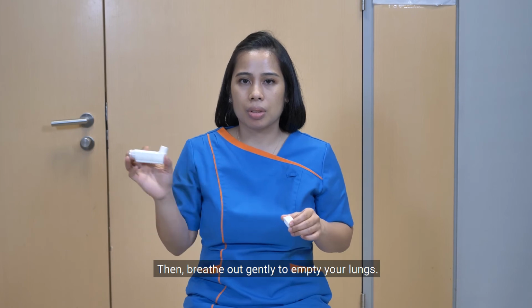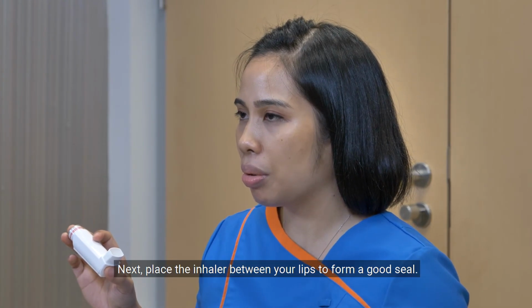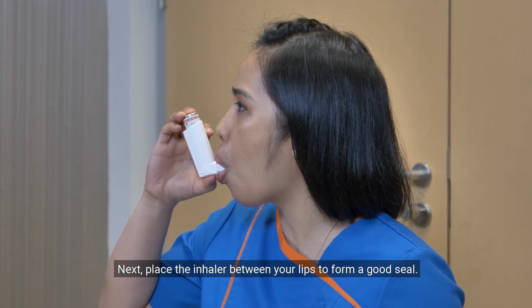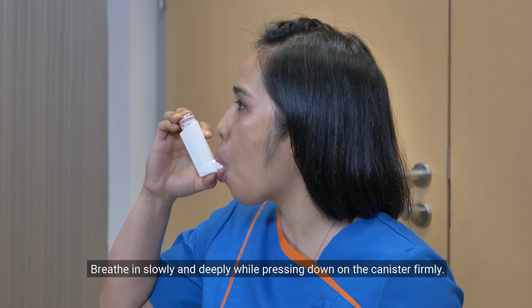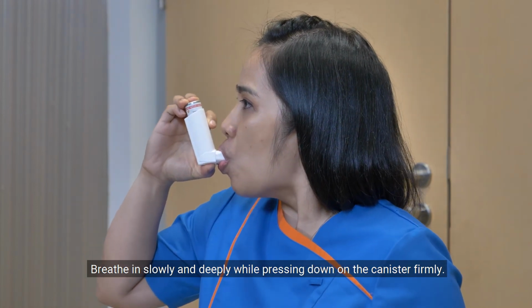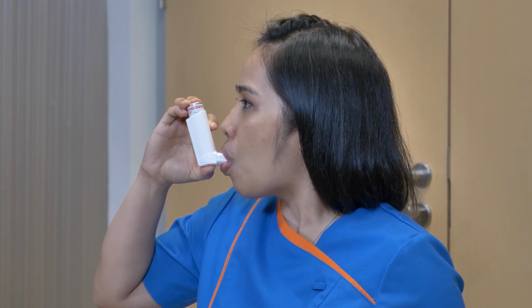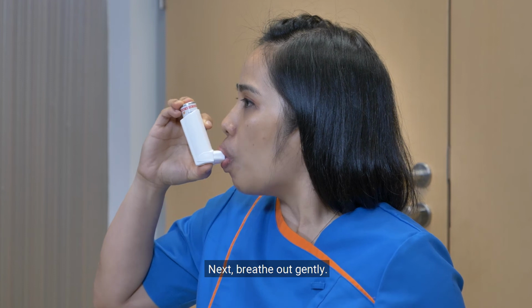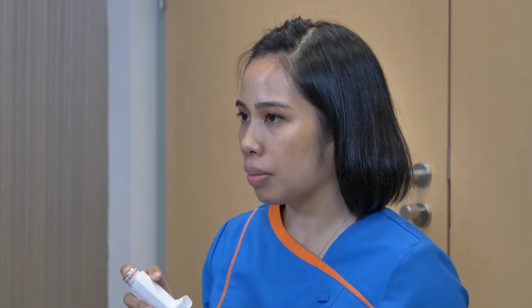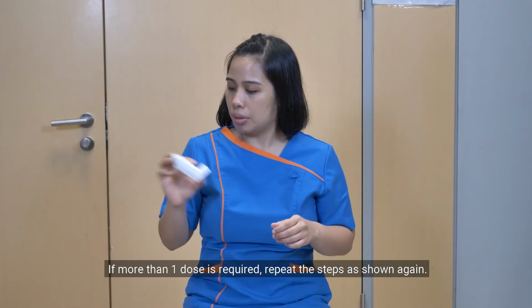Then, breathe out gently to empty your lungs. Next, place the inhaler between your lips to form a good seal. Breathe in slowly and deeply while pressing down on the canister firmly. Then, hold your breath for 10 seconds. Next, breathe out gently. If more than one dose is required, repeat the steps as shown again.